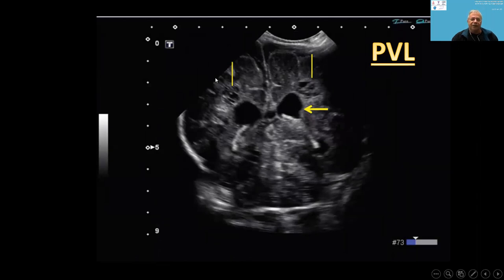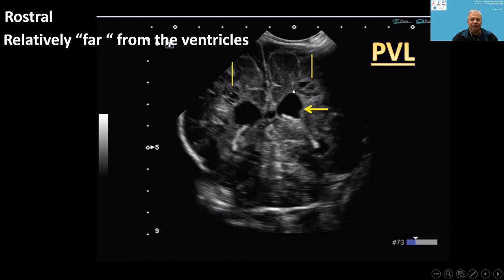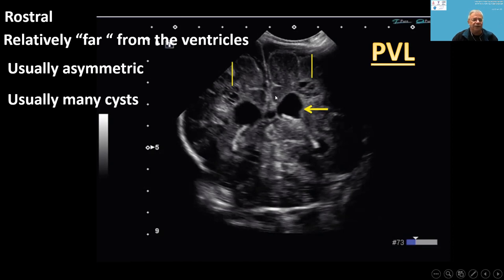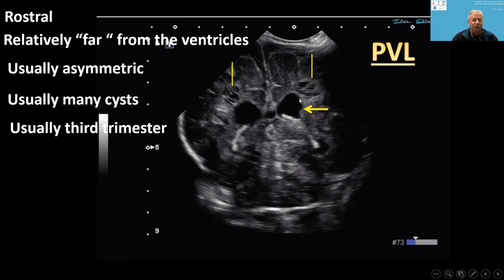On ultrasound, PVL cysts are seen high above the ventricles or lateral to them. They are relatively far from the ventricles — not adjacent. They are usually asymmetrical, not round, not well-formed cysts, usually multiple, and typically appearing in the third trimester.